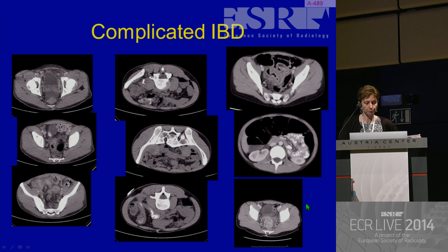This patient here was, again, imaged outside, sent to my department as possible lymphoma. And this exam had been done because somebody had seen thickened bowel loops and decided this was lymphoma, and they'd done a staging CT. Absolutely, there are thickened and abnormal pelvic loops here, but there's an awful lot of inflammation and there's nodal change there. We see thickened and abnormal loops geographically distinct from there in the upper abdomen, and again more pelvic abnormal thickened edematous bowel loops. And we sent this back to our oncologist saying, well, good news for the patient, we don't think they've got lymphoma, but we think they've got inflammatory bowel disease, which was later proven as such.